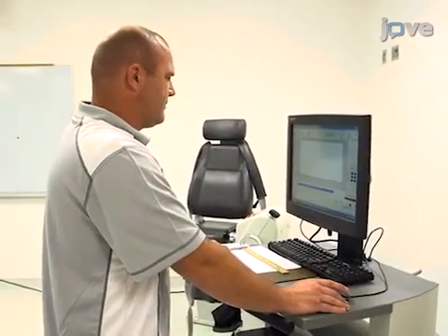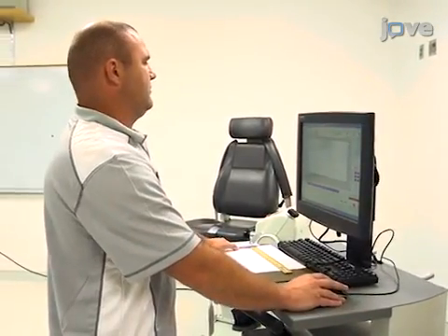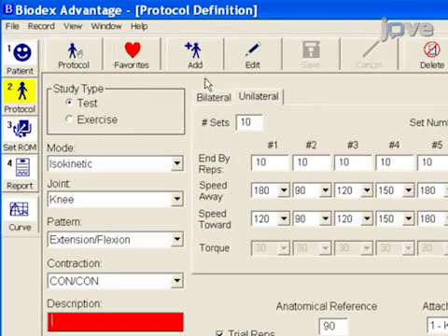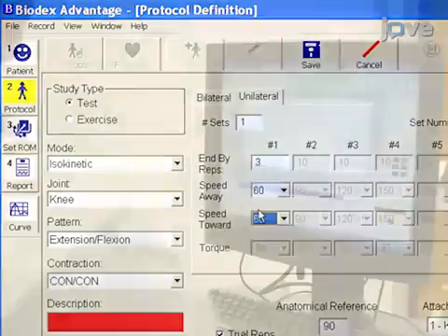To create the isokinetic strength test protocol, begin by opening the dynamometer control software on the computer. Select New Protocol from the drop-down list. Then, on the Unilateral tab, program one set of 3 repetitions at a speed of 60 degrees per second for both the away and toward contractions by entering 1 into the number sets field, typing 3 in the end by reps row, and typing 60 in both the speed away and speed toward rows.